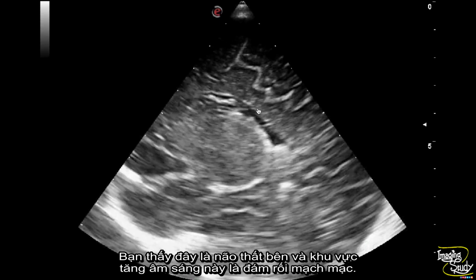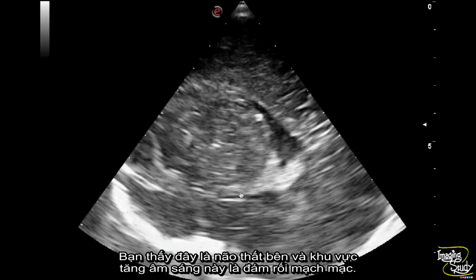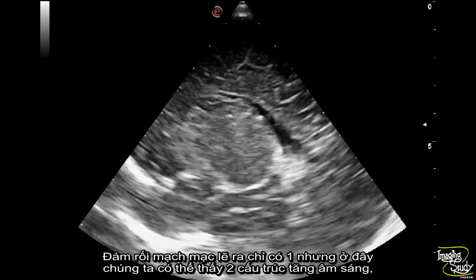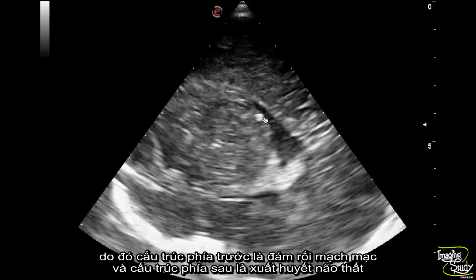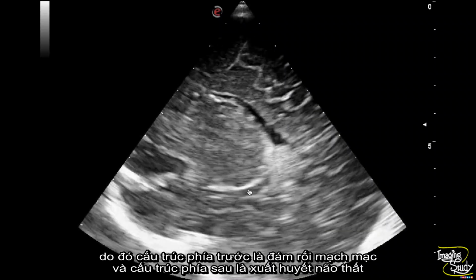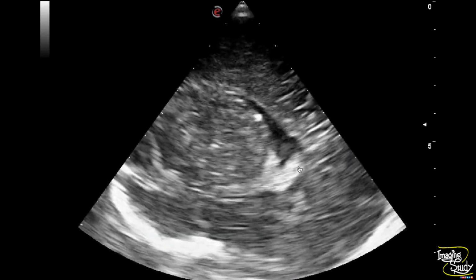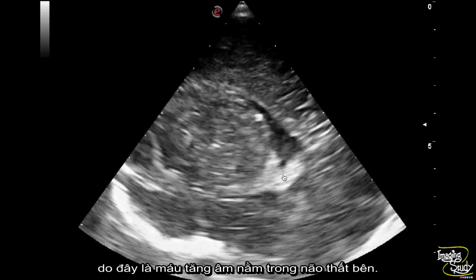You see this is the lateral ventricle here, and this bright echogenic area is the choroid plexus. Now the choroid plexus should be 1 in number, but here we can see 2 hyperechogenic structures. So the first one is the choroid plexus and the posterior one is nothing but the intraventricular hemorrhage. So this is the echogenic blood at the dependent part of the lateral ventricle.